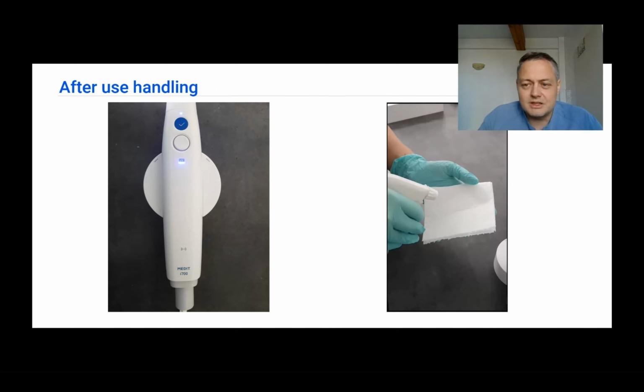What happens is that the scanner has a fan inside that blows air through the scanner from the posterior part to the anterior to cool it off. And because aerosols are present in your operating room, these aerosols are drawn into the scanner, and they might infect the inner part of the scanner, and these little droplets can then be expelled to the next patient.